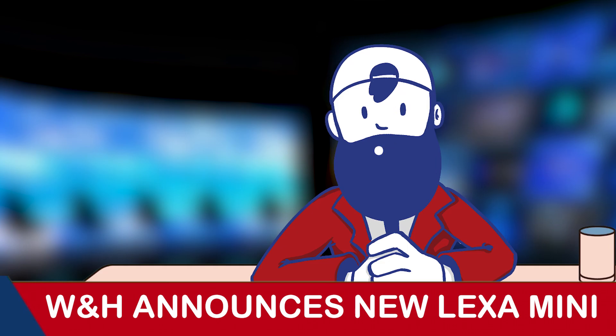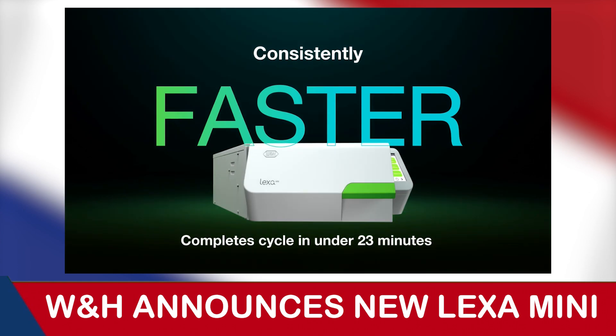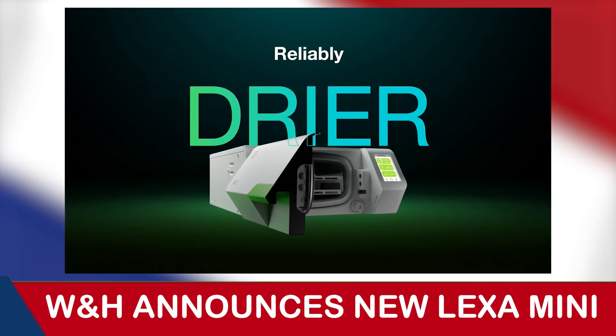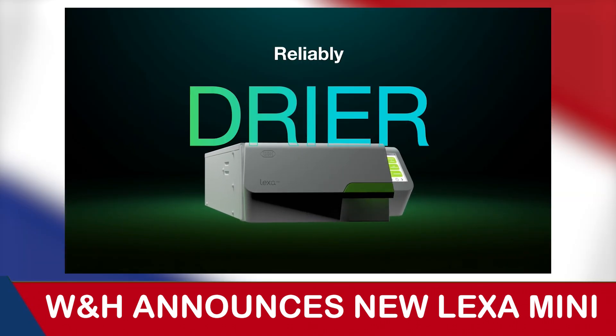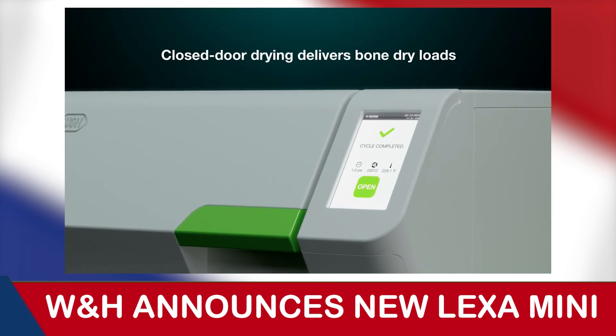For the Lexa Mini, speed is the name of the game. Able to outshine other compact sterilizers with cycle times of just 23 minutes, including drying time. It also offers closed door drying technology, minimizing the risk of cross contamination by delivering bone dry loads each and every time.